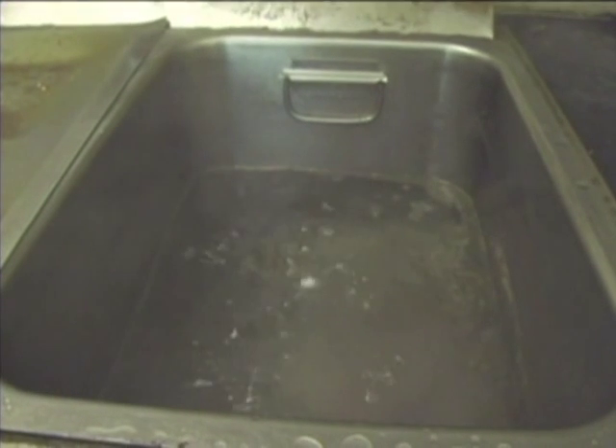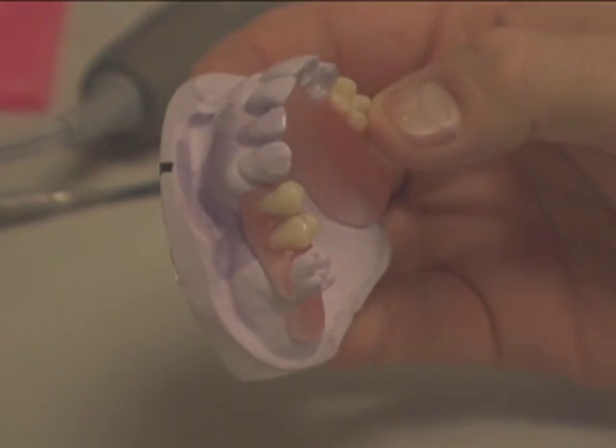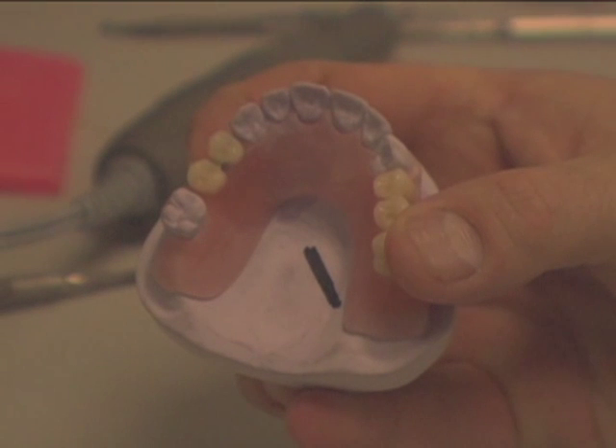Remove wax — boil out. With the putty matrix removed, boil off the wax from the model and partial. Make sure there is no wax remaining.